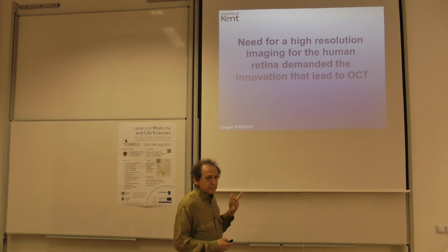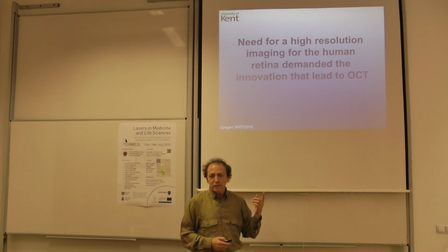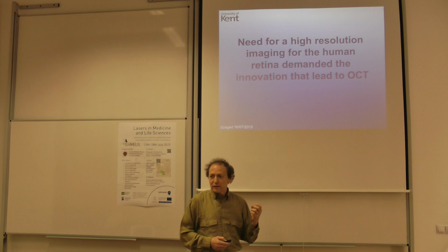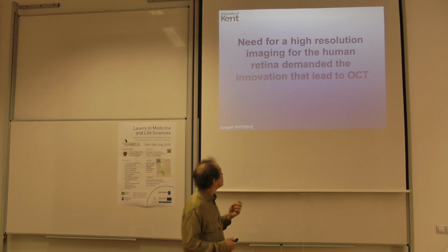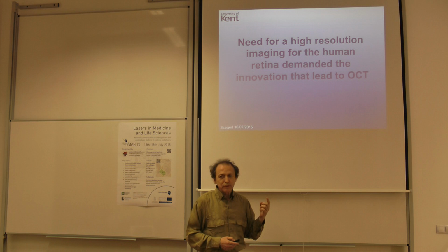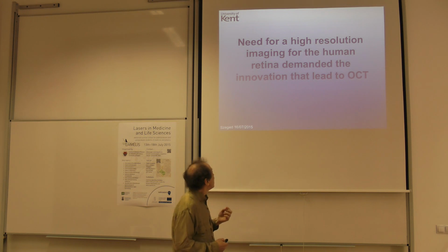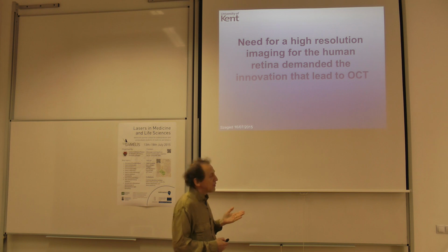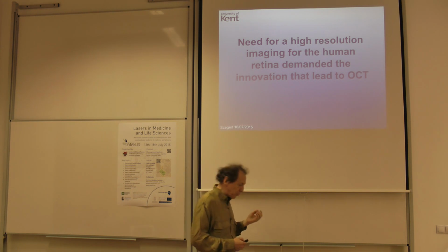Now, does anyone have any idea why OCT has been created? It responded to a need. And what was the need which led to the development of the technology? Of course, we all needed high resolution. However, there was a problem.